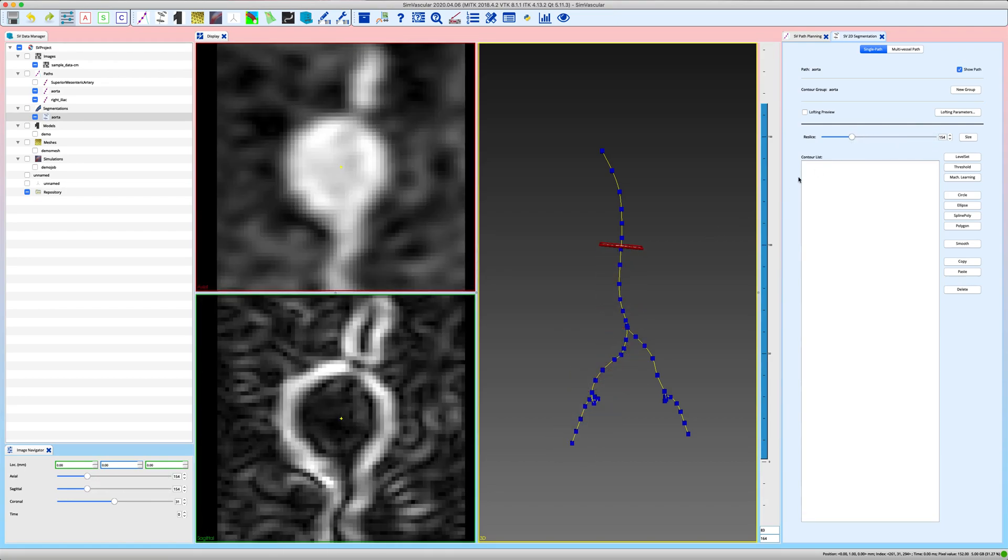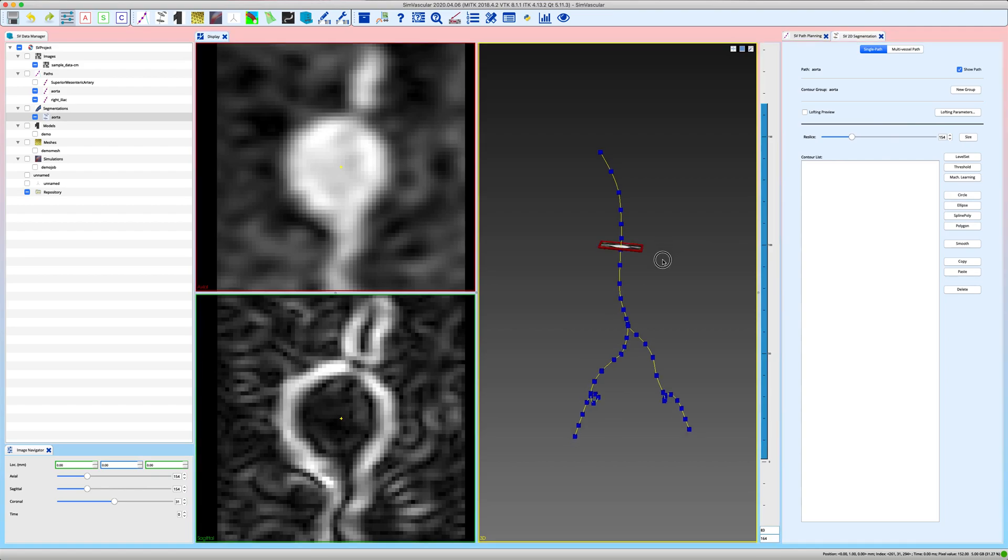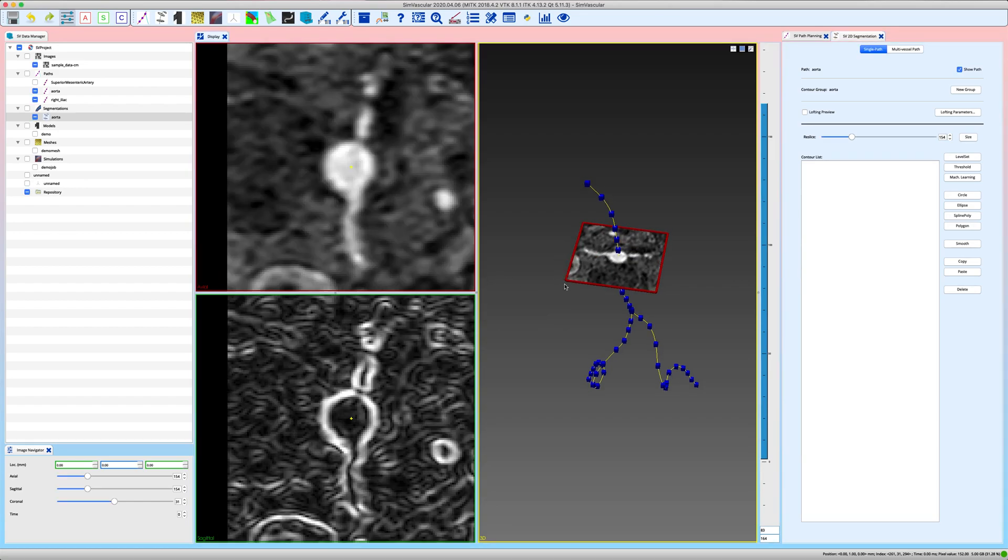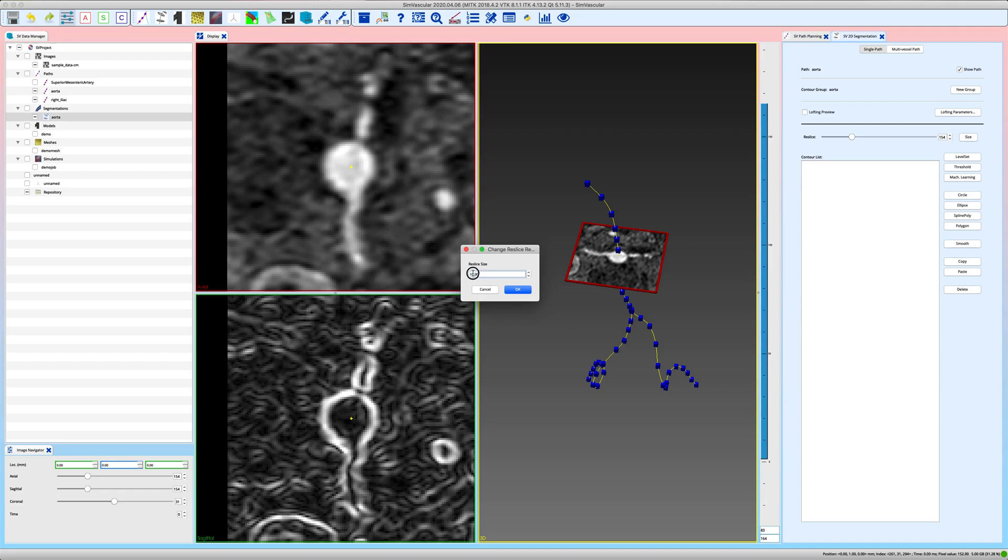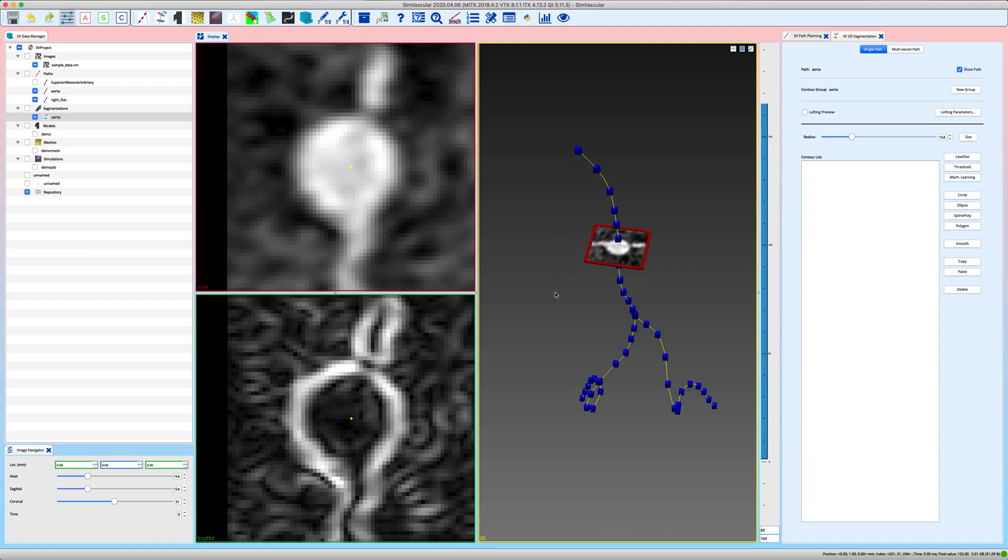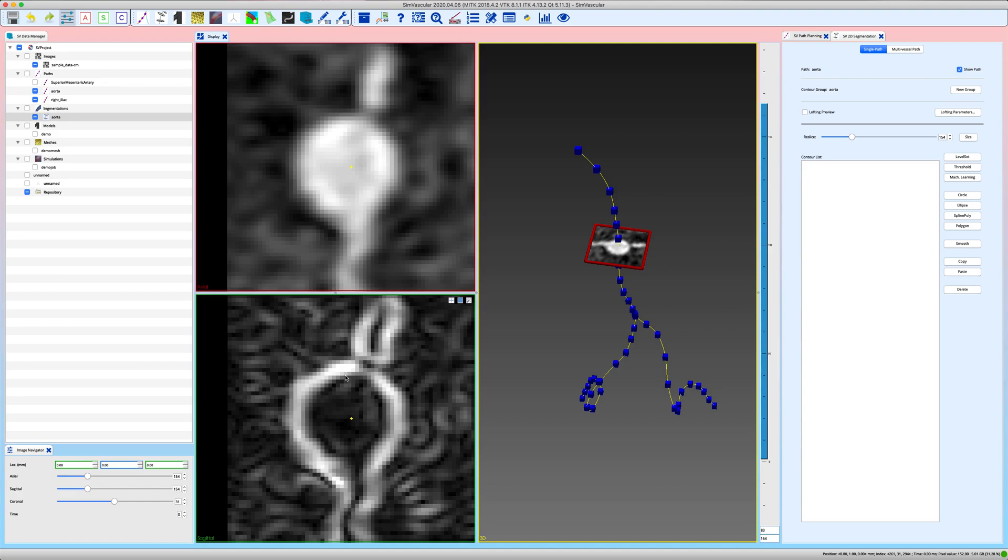Okay, if you want to change the size of this reslice window you can do this over here, because sometimes your vessel might be bigger and you want to increase the size. You have to click into the window to readjust the view, or for our example 5 was actually just pretty good. So let's go back to 5. Click in the window again, and in the left upper window you can see the image intensity, and in the left lower window you can see the magnitude of the image intensity gradient. So the highest values in this image are the steepest changes in image intensity over in the upper image.